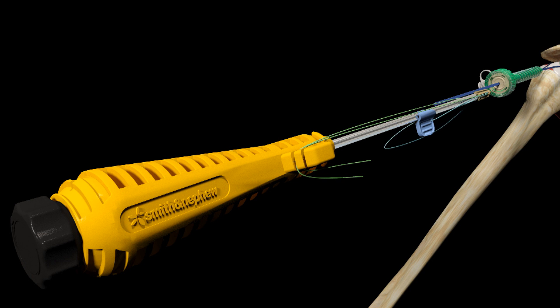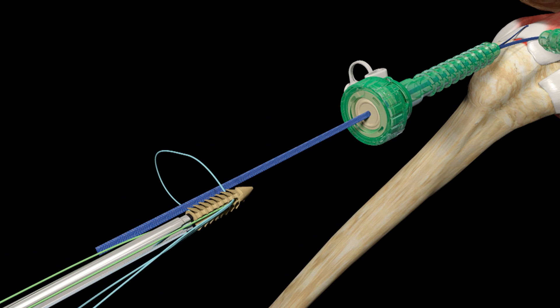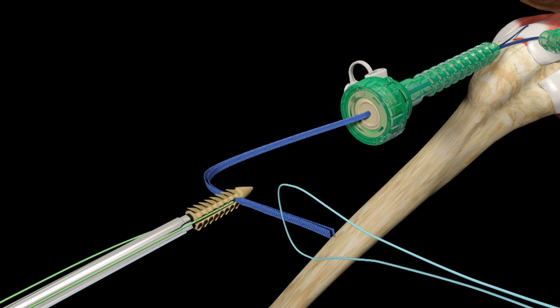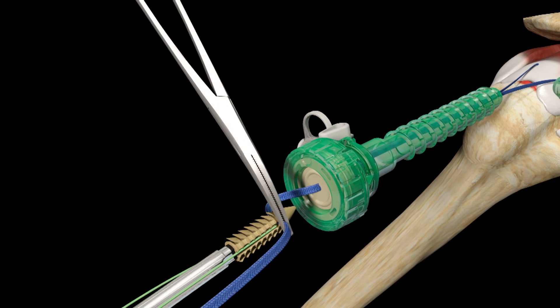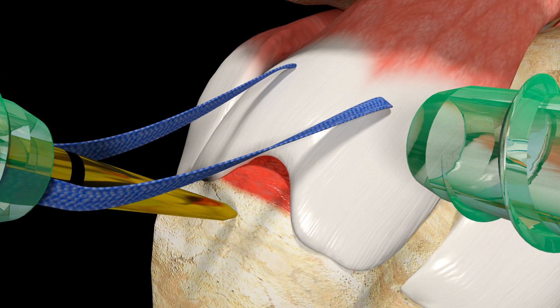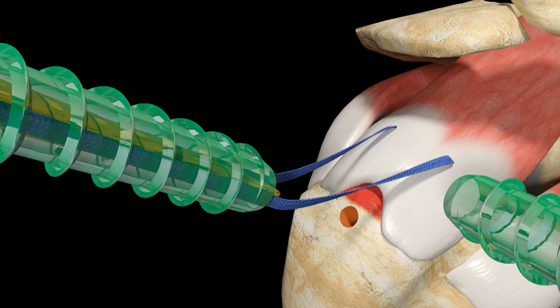Outside of the shoulder, load both limbs of Ultra Tape Suture into the Footprint Ultra PK Suture Anchor eyelet by first feeding them through the released threader loop and then by pulling on the threader tab. Clamp a hemostat over the loaded Ultra Tape Suture to hold in place while a pilot hole is created. Introduce the gold tapered awl into the lateral cannula and create a pilot hole at the anterior lateral aspect of the greater tuberosity, tapping to ensure the black laser line on the awl is flush with the surface of the bone.